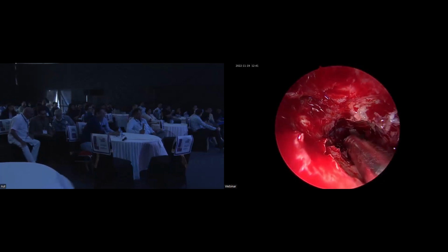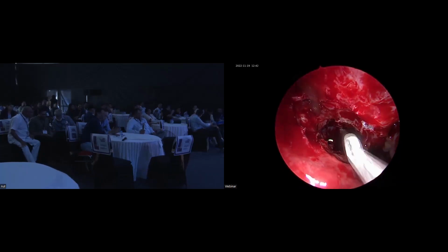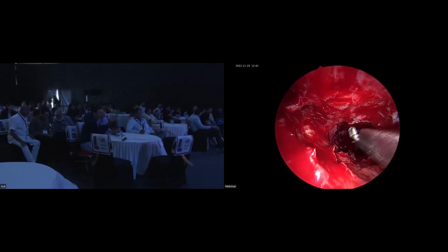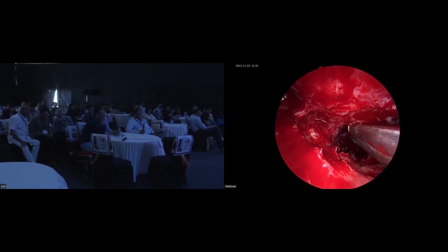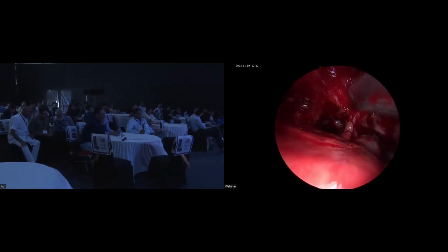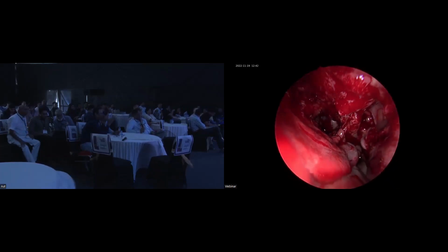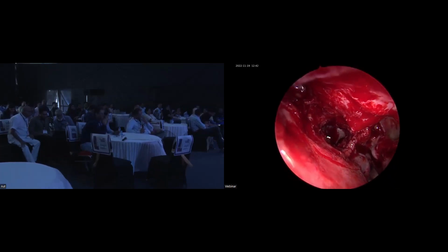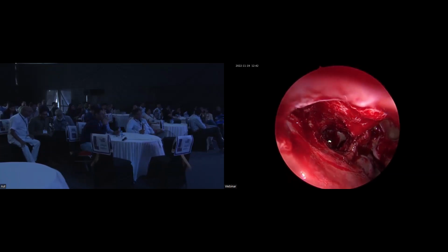Punch, please. You must remove all the bony spicules because otherwise it causes osteitis and doesn't allow the area to heal well. Heller cell. Debrider, please. Yeah, there is one. It's a tiny Heller cell.